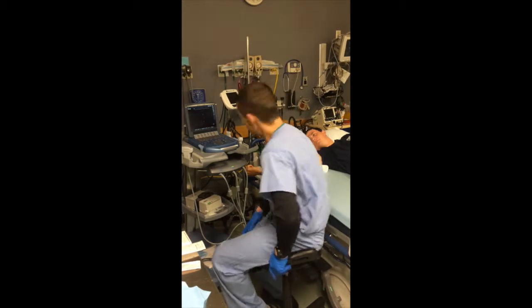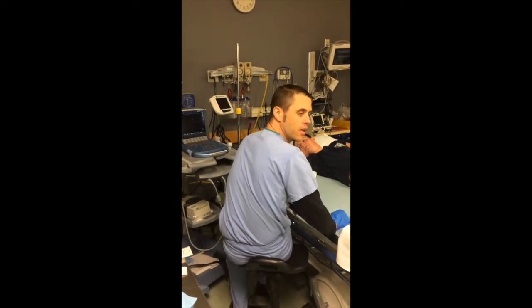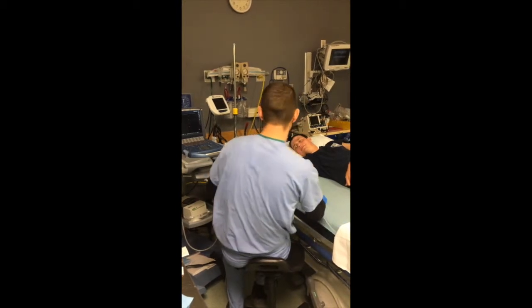Hey, welcome to Your Nurse Pro. This is the first video cast. We're going to show you how to insert a peripheral IV using ultrasound guidance.